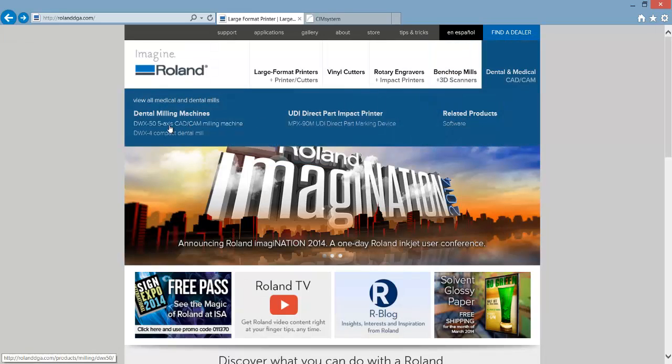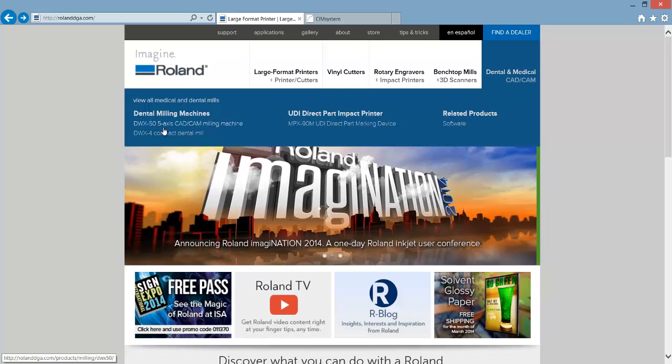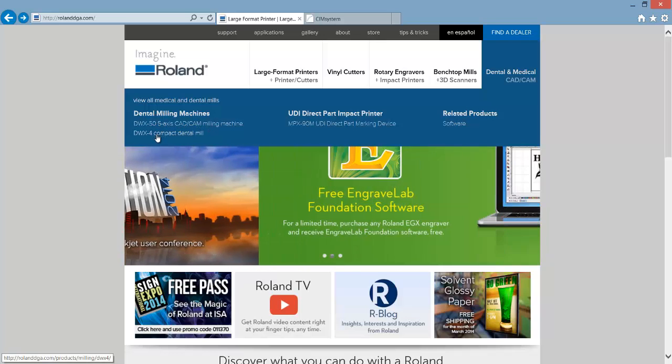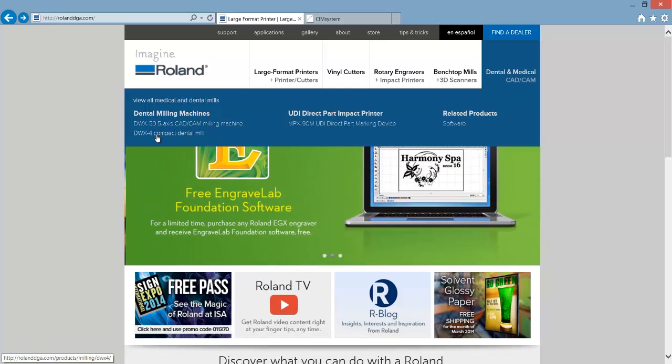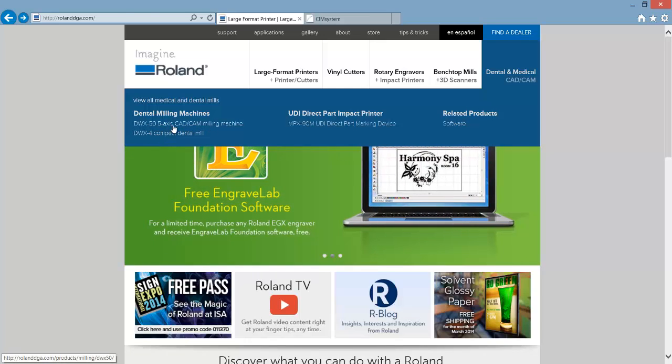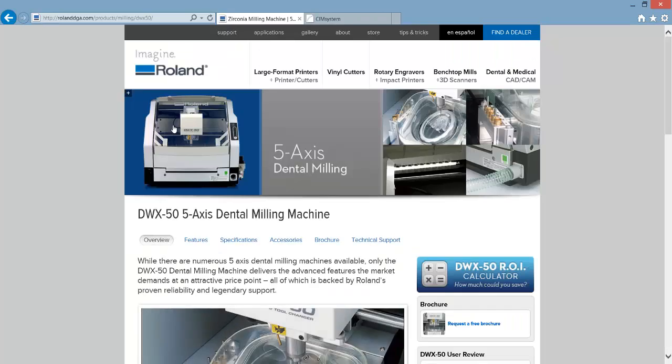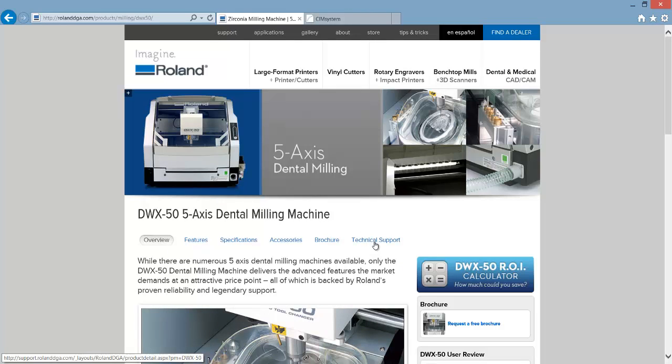From there select either the DWX50 5-axis CAD CAM Milling Machine link or the DWX4 Compact Dental Mill link. Once the appropriate page is loaded go to the Technical Support link.